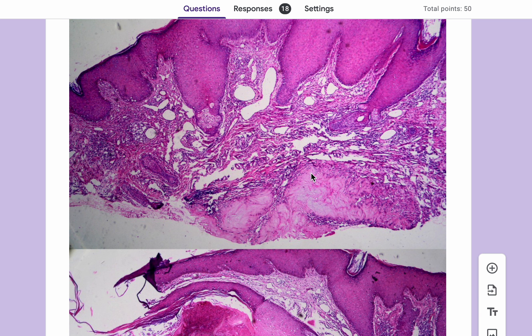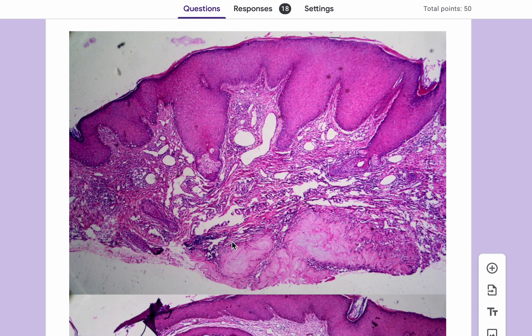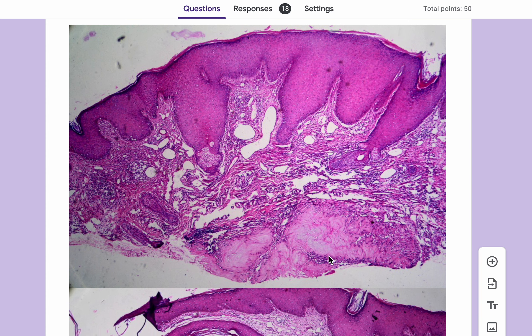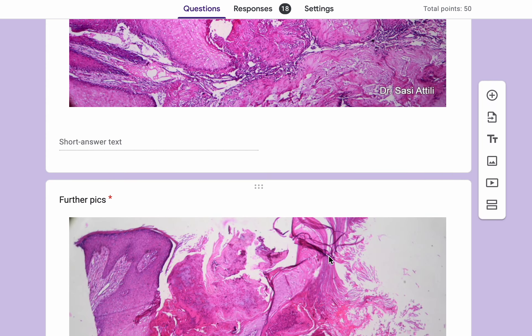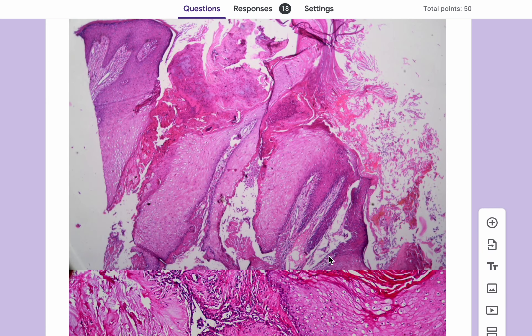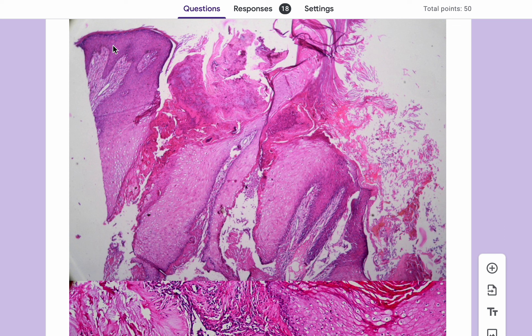There is transepidermal elimination of this sort of amorphous pink material, which you can appreciate here even on low power. This is quite nicely seen in this image. These amorphous pink blobs are often described as cotton candy, and if you look at higher power, yes, there is marked pseudoepitheliomatous hyperplasia and epidermal pallor, which you may confuse with keratoacanthoma.